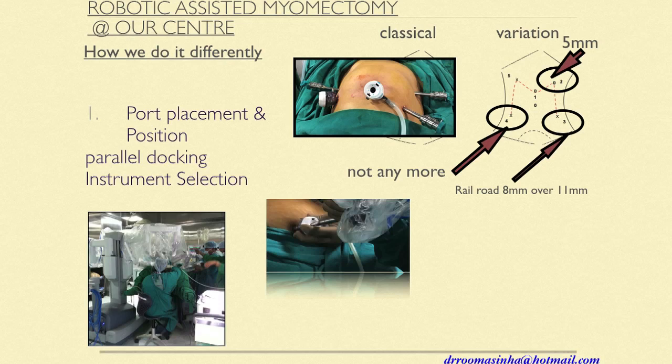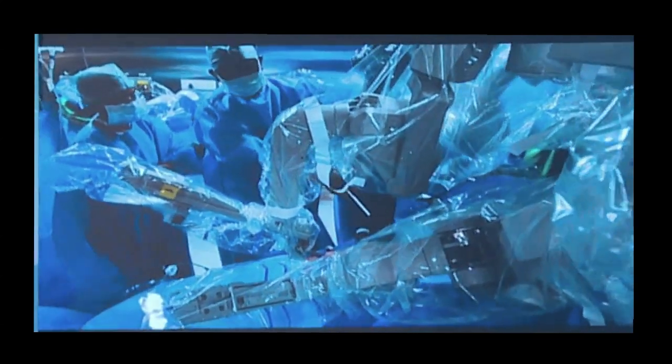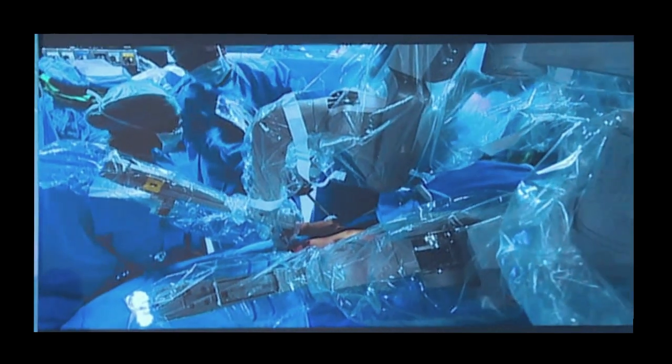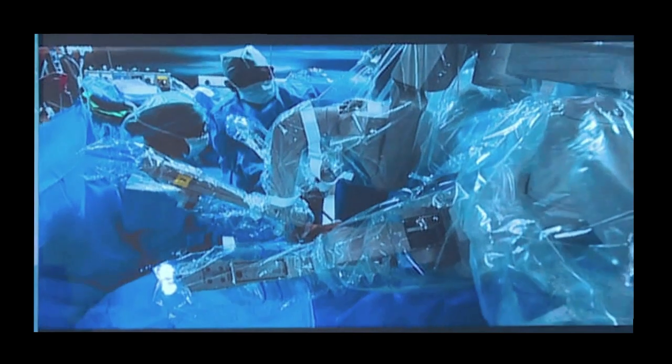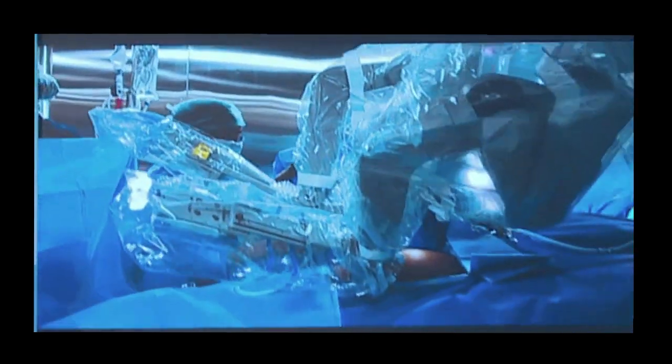Here is the railroad demonstration. The primary port on the left side of the patient is an 11mm port, and you can see an 8mm being railroaded through it. The benefit is that the 11mm port helps me pass my needle — otherwise I would need another 11mm port at the upper part. If you have the bariatric longer ports, you can railroad through and then dock the arm onto the 8mm. Whenever you need to pass a needle, you just pull out the 8mm, pass the needle, and return it. This reduces one port and simplifies the procedure for the patient.